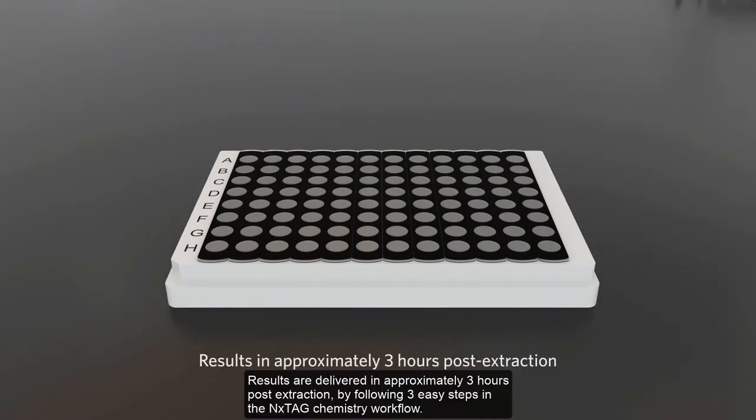Results are delivered in approximately three hours post-extraction by following three easy steps in the Nextag Chemistry workflow.